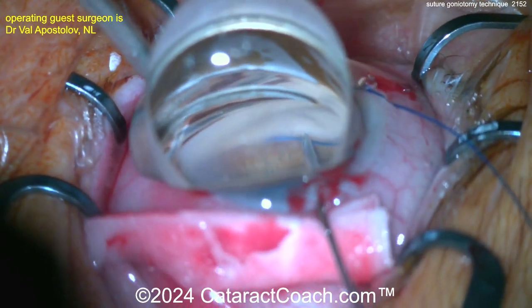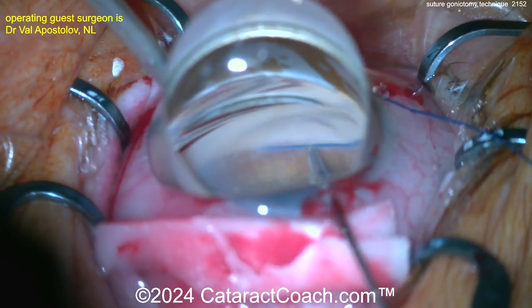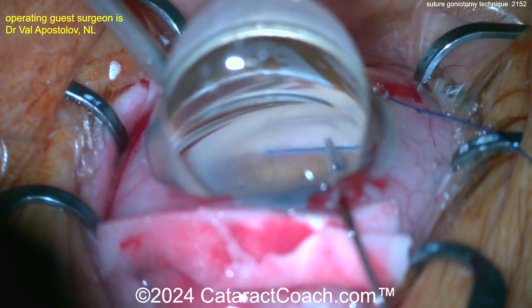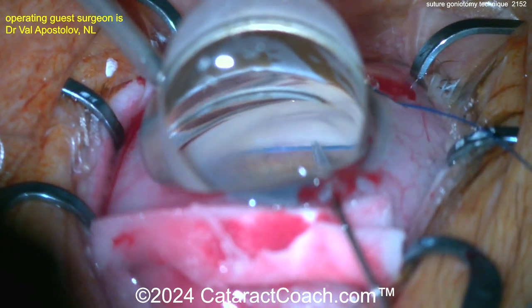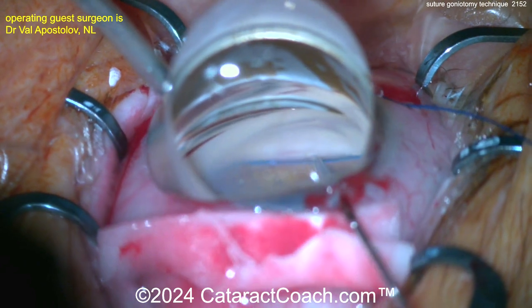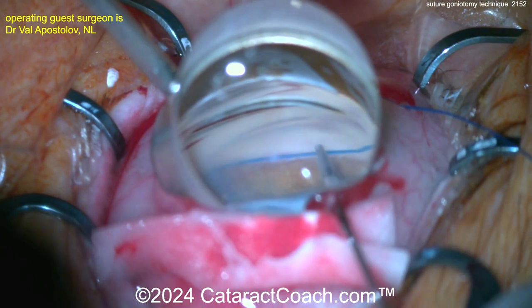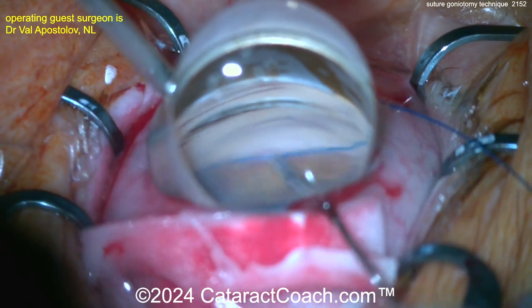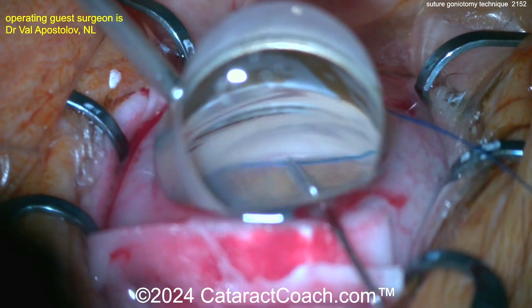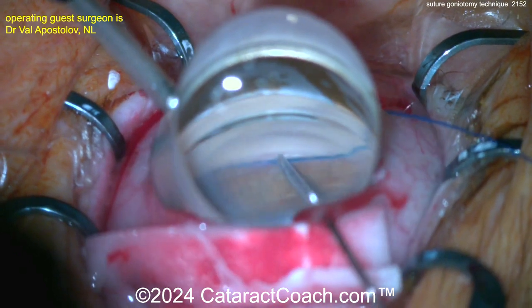Grabbing it gently with the forceps — you can see it requires very little effort and it goes around very easily. You want to pass this around nice and easy, taking your time. The left hand is holding the gonio prism on top of the cornea, and the right hand is slowly advancing it about a clock hour at a time, so it's going to take about a dozen passes to get it all the way around.